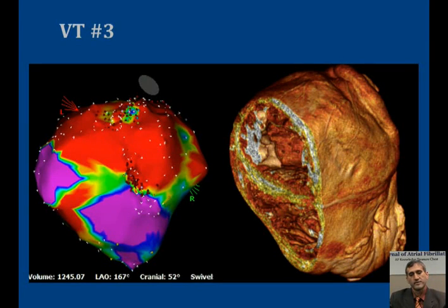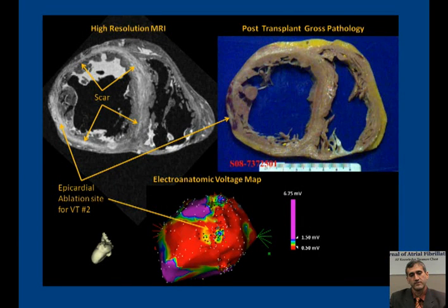If you compare side by side the MR image to gross pathology, you can see that the MR image actually carries a lot more information compared to the gross pathology. The lesion is visualized on gross pathology, but the MR image shows quite a bit of detail in terms of the scar architecture and the depth of tissue.